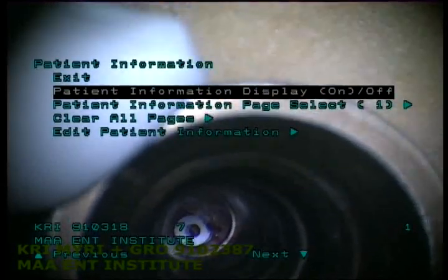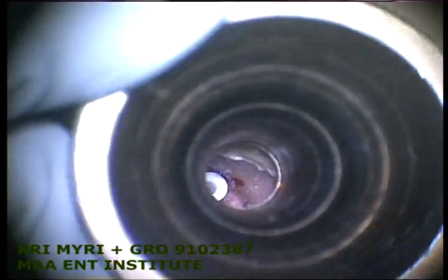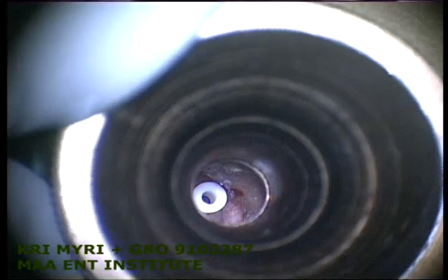With the conventional myringotomy, bleeding can sometimes block the grommet — a blood clot will form which can obstruct it. This is a perfect size of myringotomy; we can put the grommet in no time without bleeding, and this will help us maintain a patent grommet for a long time.